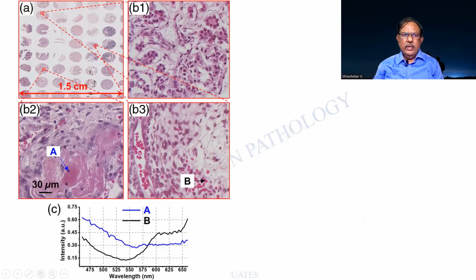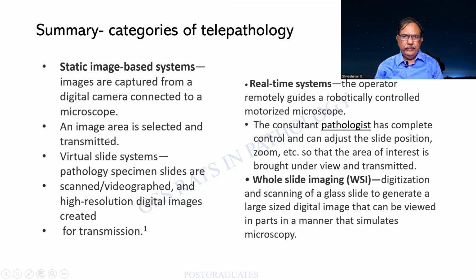And this is how it is. So when it is being scanned, I get multiple pictures of it and different pictures are being taken. And look at it, it is amazing. There are different fields and the image that I get in different fields are totally different. There is a glandular component which is totally missing over here. I am seeing them as individual cells. And there can be some other areas of hyalinization or fibrinoid necrosis. And this is a summary. I would like you people to kindly memorize this particular slide.